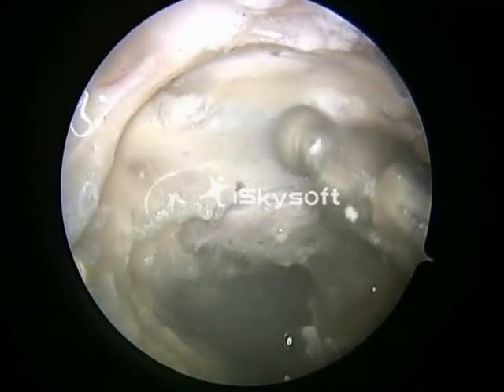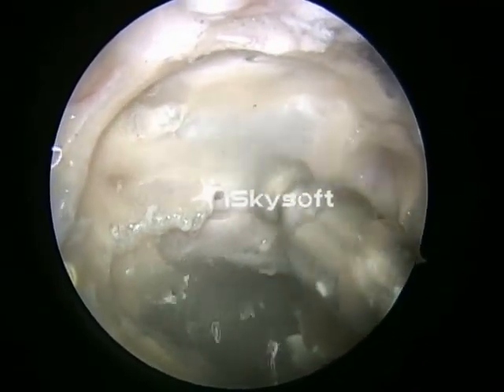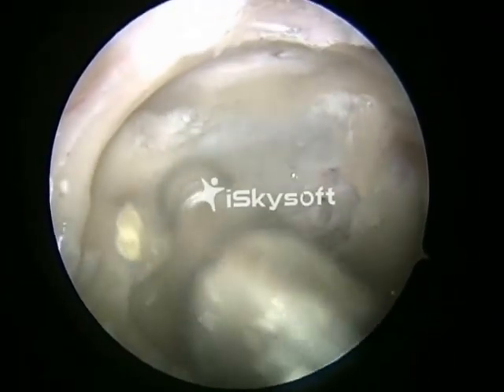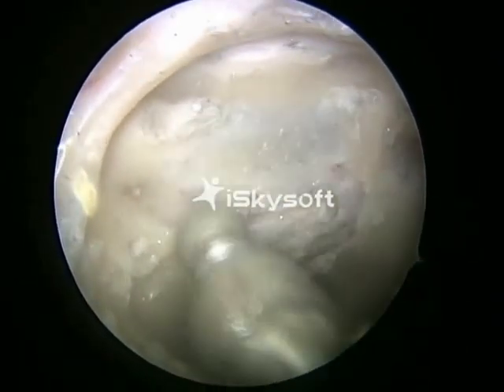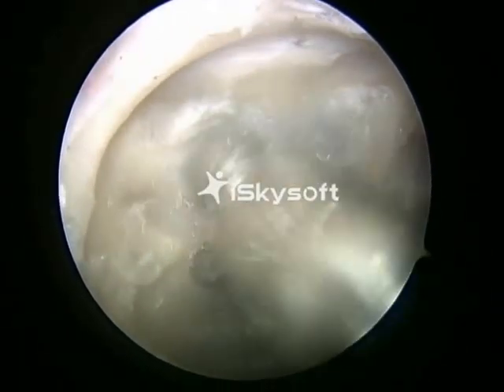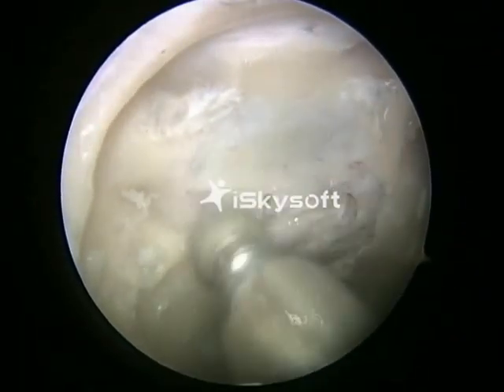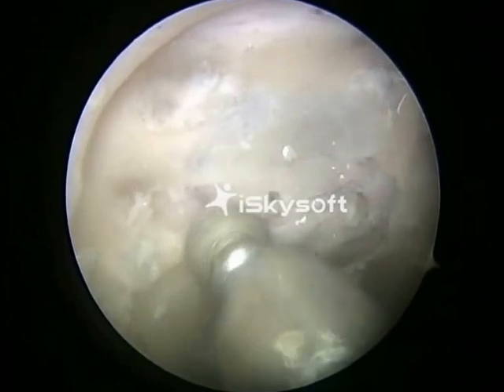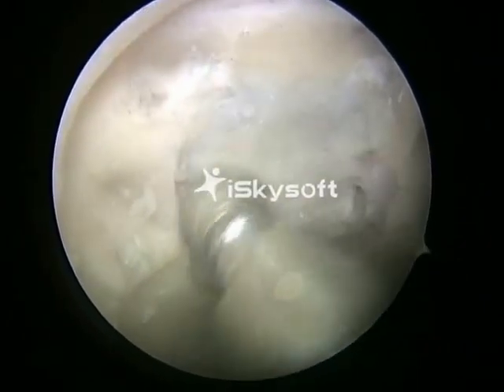It's like a cobra on a peanut. The 2 cobras are the internal carotid arteries, and the peanut is the pituitary gland. So, for a transtubercular approach, the bone is drilled in a curvilinear fashion on both sides.